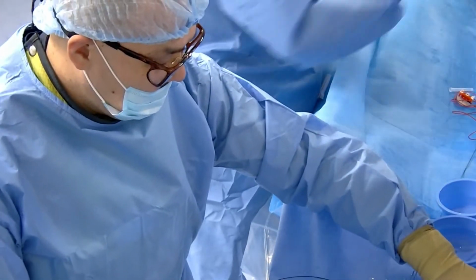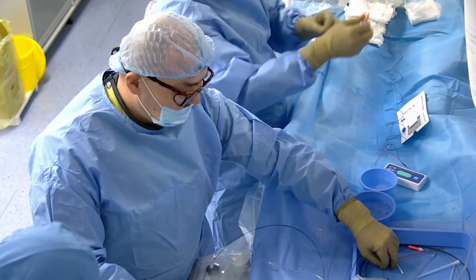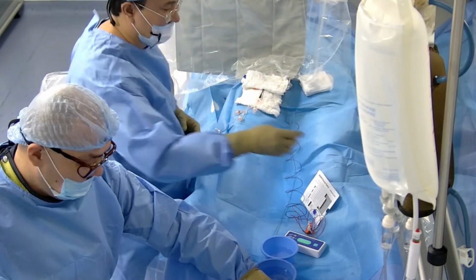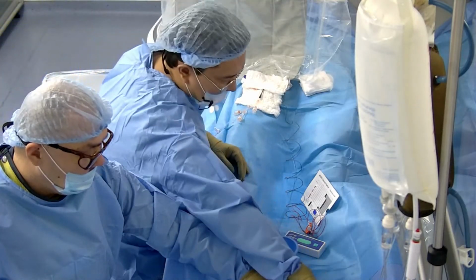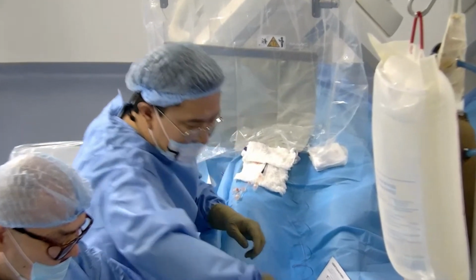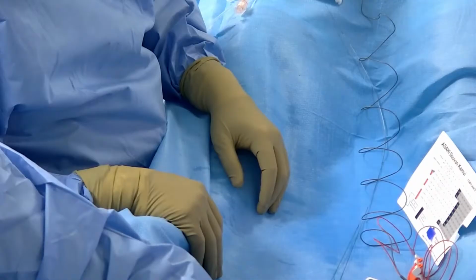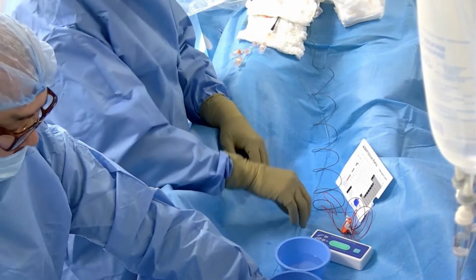They helped to find one detachment system. The sterilization of the detachment system is nearly impossible. And the new one is costly. It costs nearly $400 or $500. That's why we decided to stop using the Kaneka. It will be the last time when we deal with these coils.